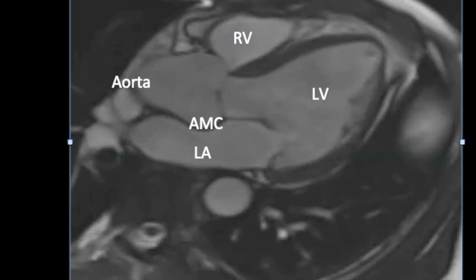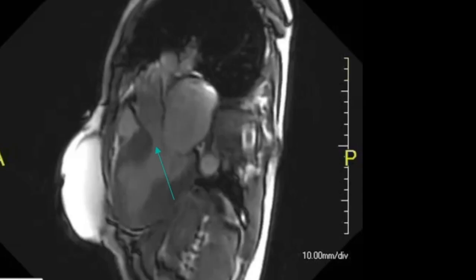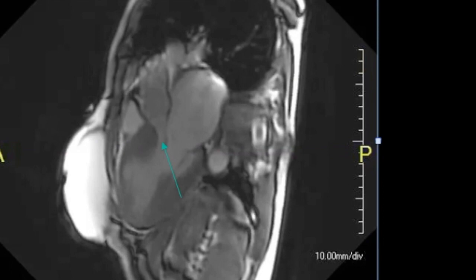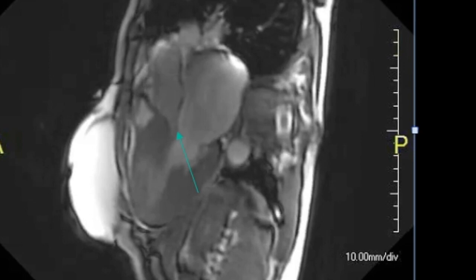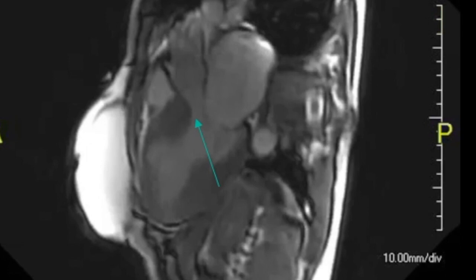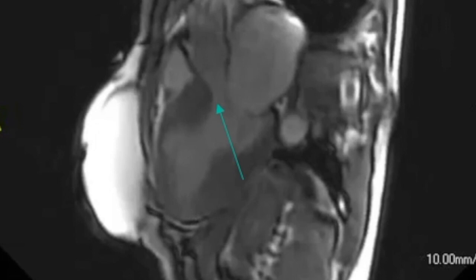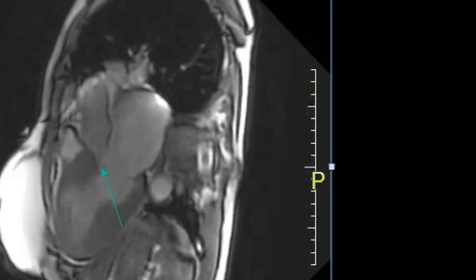I've put up the three-chamber view again to depict the systolic anterior motion in a patient with hypertrophic cardiomyopathy. In this first video or the first cine loop where we see severe left ventricular outflow tract narrowing because of the systolic anterior motion of the mitral leaflet and the basal septal hypertrophy. We can also see flow acceleration in the region of the LVOT. The second patient again has hypertrophic cardiomyopathy with basal septal hypertrophy but there's no SAM and there's no LVOT narrowing or obstruction.